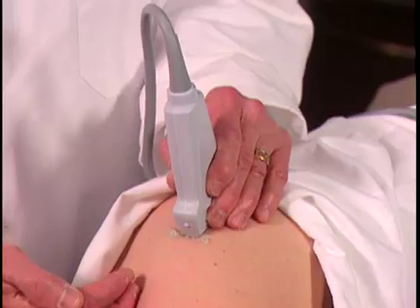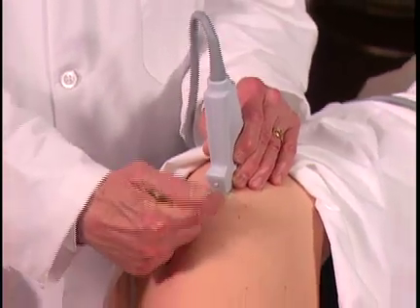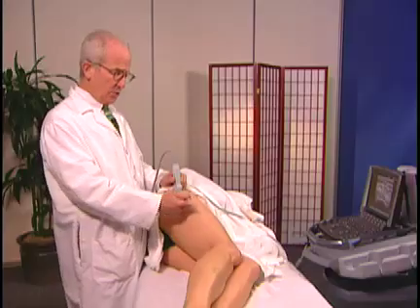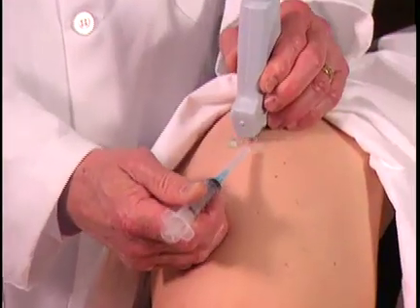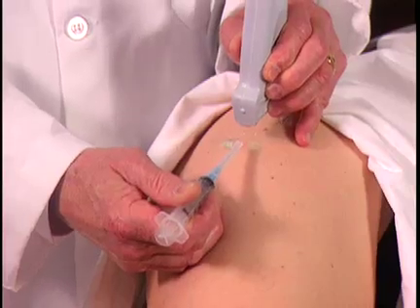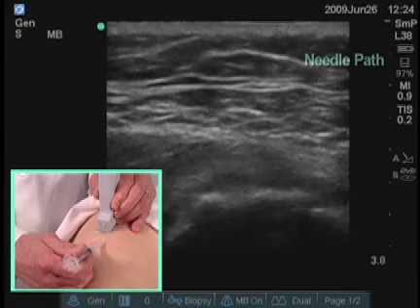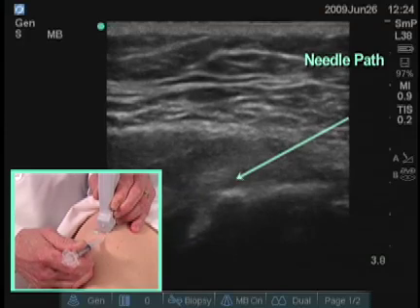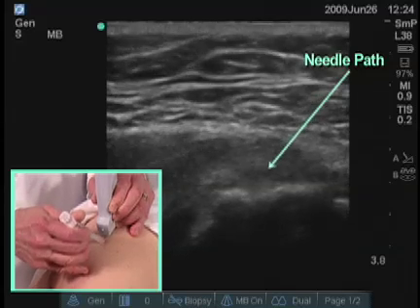This injection could be performed with the transducer in a longitudinal position coming in this way, or could be done transversely with the transducer in this position. I'm using an in-plane approach — the needle and the syringe are parallel to the direction of the transducer. I would then insert the needle approximately a centimeter away from the transducer. The closer you get, the more steep the angle has to be to get down to this depth.